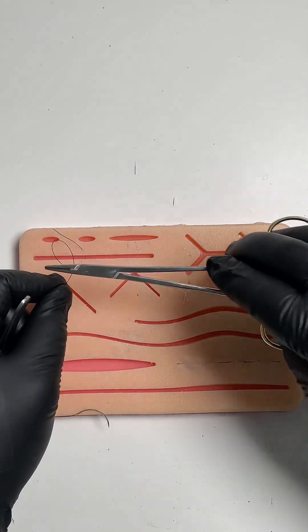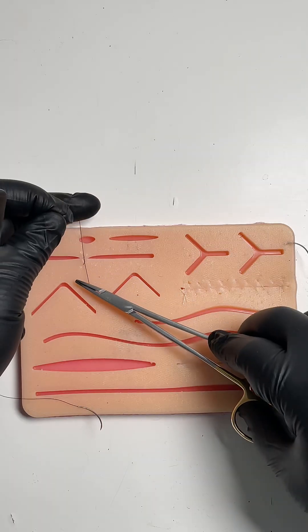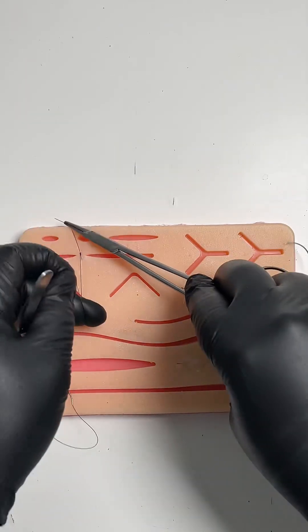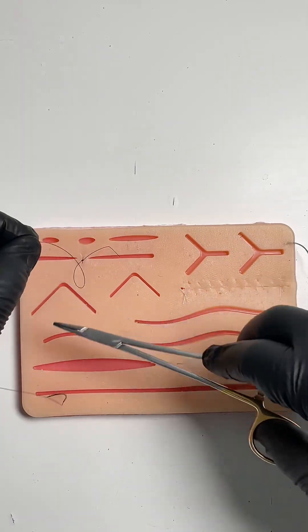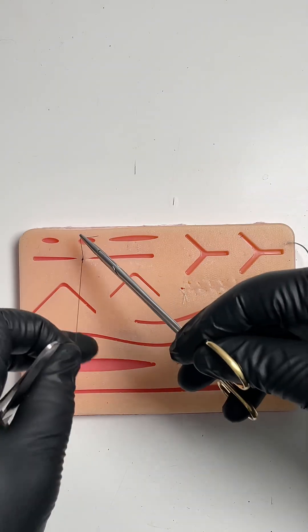And then as always push forward — one, two — use your finger. We're not doing this big motion; we're just using our fingers. Put everything into one hand.